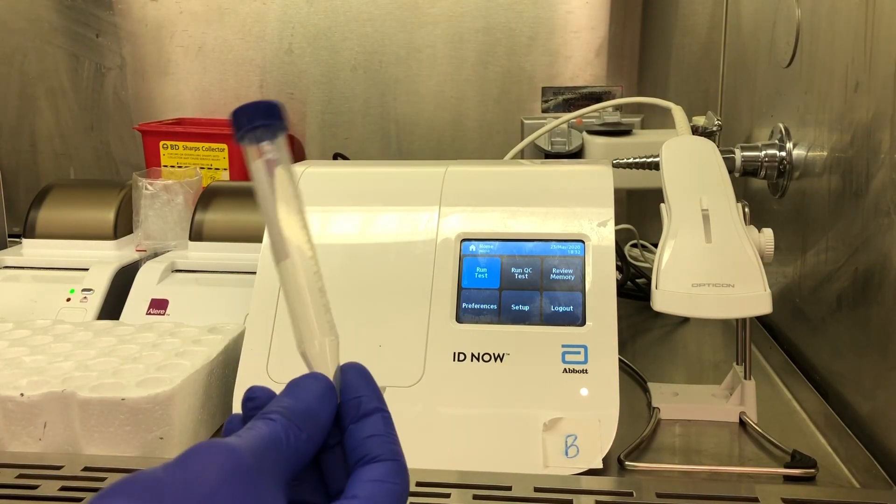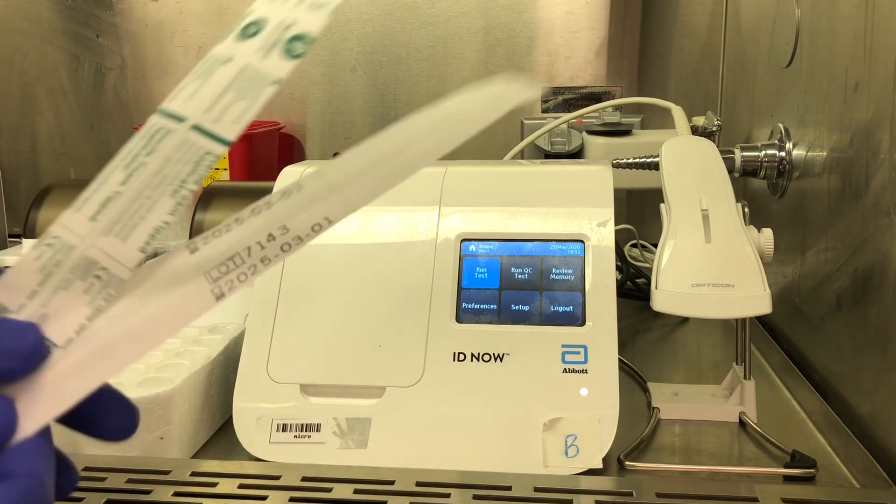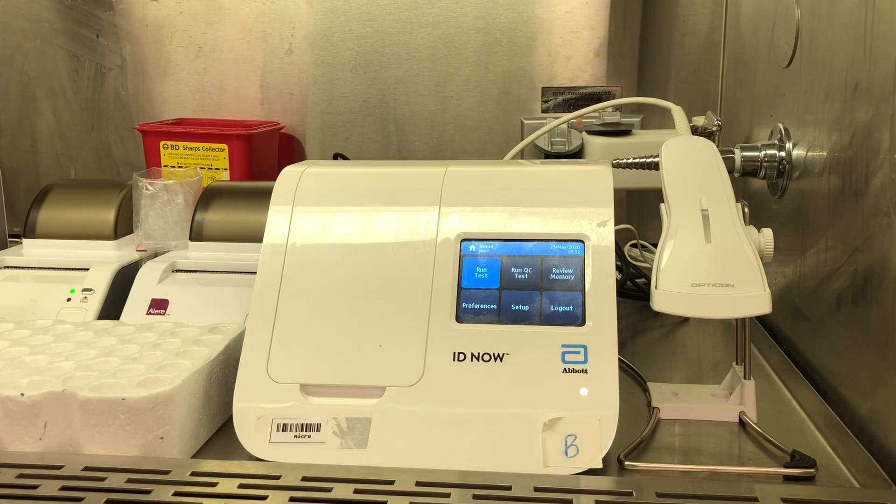For the COVID-19 test, we've stopped using VTM and we've started just using sterile tubes. We've been collecting nasopharyngeal and oropharyngeal specimens for each COVID-19 test that we've been running.